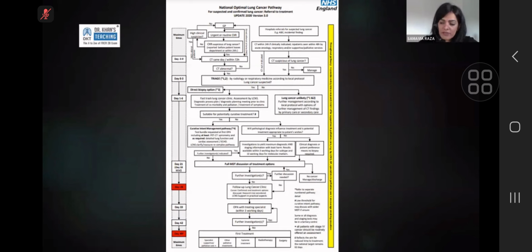Initially, or conservatively, the ask was to do a routine chest X-ray or an urgent chest X-ray to look for cancer. But we now know that X-ray has very low sensitivity for excluding small stage lung cancers. So if you have a high enough clinical suspicion, you should ideally be going for CT. The way we do it, we go straight to CT. We don't bother with the chest X-ray, especially when you have somebody aged 40 plus who has hemoptysis. You deserve a same day CT. You ideally need to have cancer excluded with a CT, regardless of what the X-ray may or may not show.